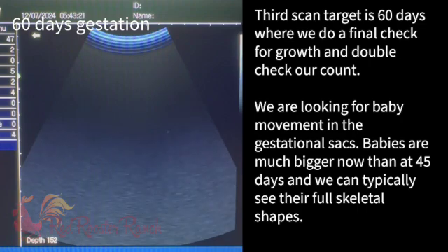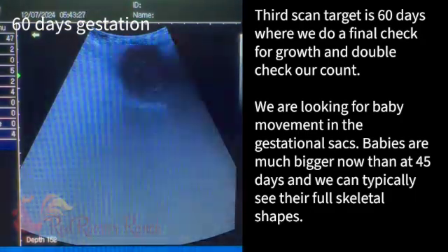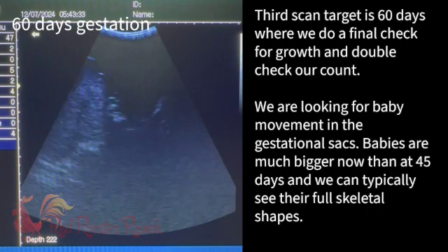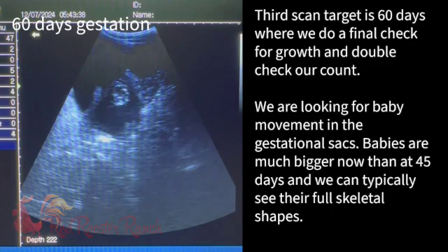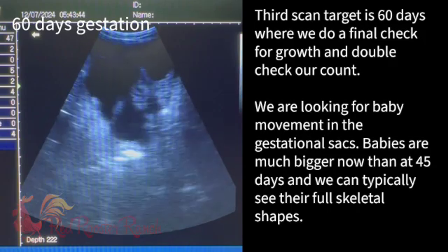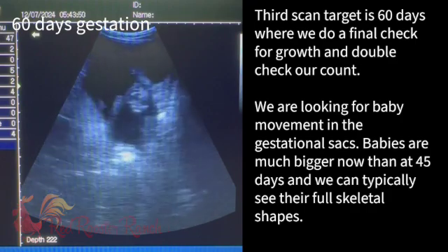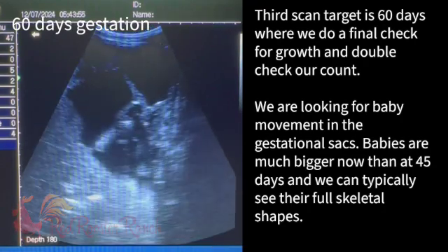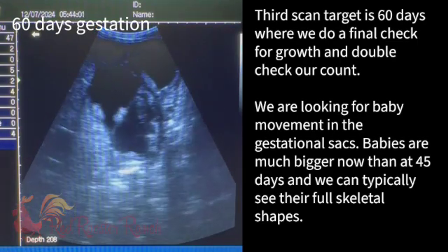She's 60 days. You can definitely see the skull — that darker white — that's what we're looking for in the shape, the body shape. The black is the fluid, so that's the amniotic fluid. And there we see some legs coming down now. We're looking for white shapes in the shape of babies and some movement.